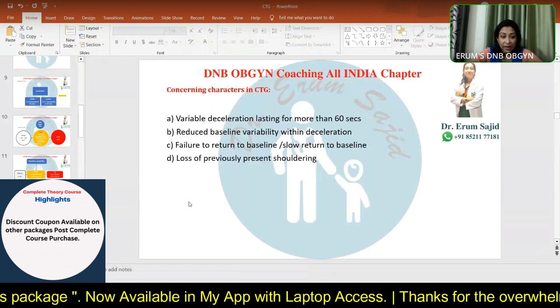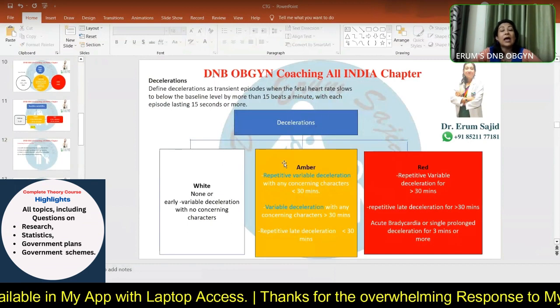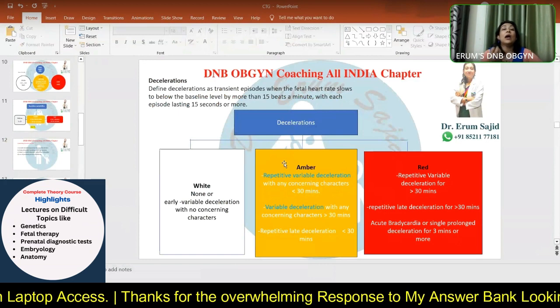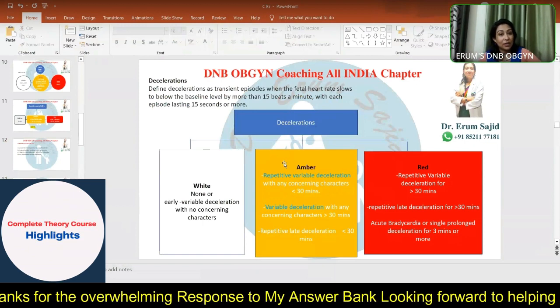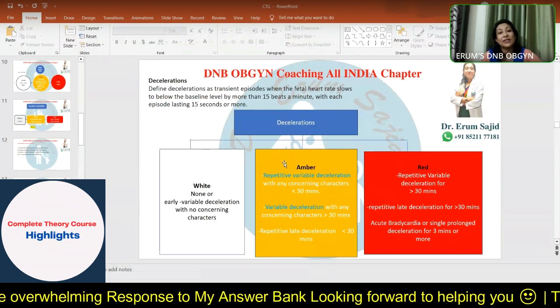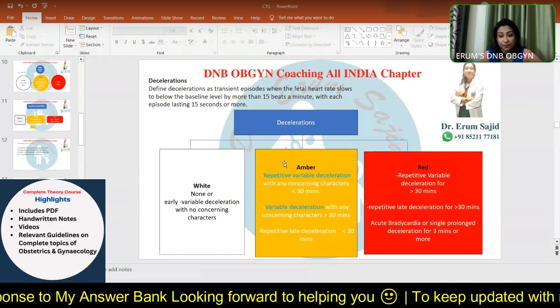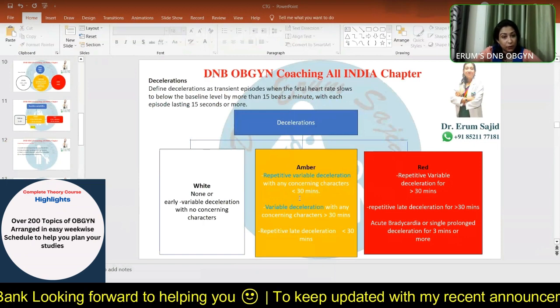With this background in mind, now we go to this slide. Okay, it's a confusing slide. I wanted you to have a base before I discuss this slide with you, and I'll not be discussing it in this complicated way. I have another slide coming on the next page, which is going to be far easier to make your picture memory, which is the idea behind taking this class. So let's go to the slide which I've made for you.